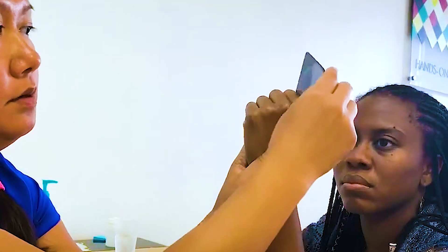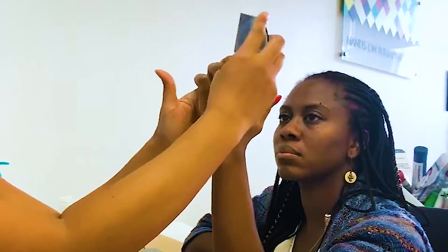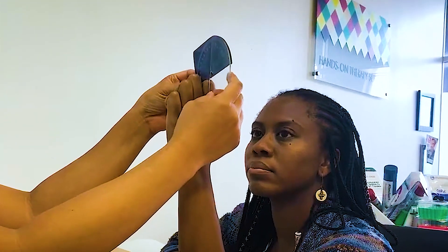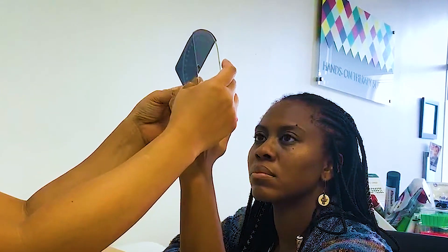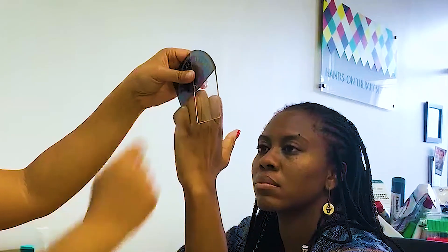You can put it between your fingers and slide it — I'll have one hand here to help make sure that they're not going into flexion with their wrist. Go ahead and open your fingers, and then curl down around my fingers. This is how I measure IP — just put the half moon right over the fingers and get that angle. 110, 100 — almost 118 right there. It just sits right over the skin and the knuckle.